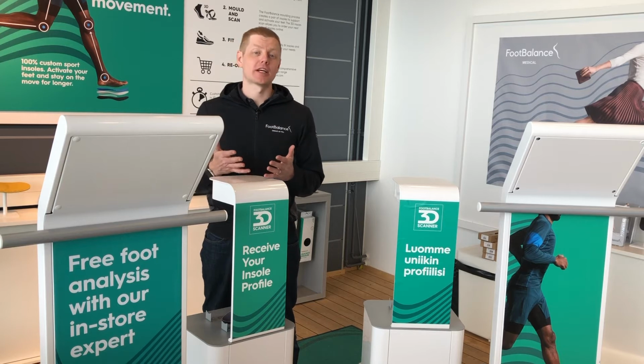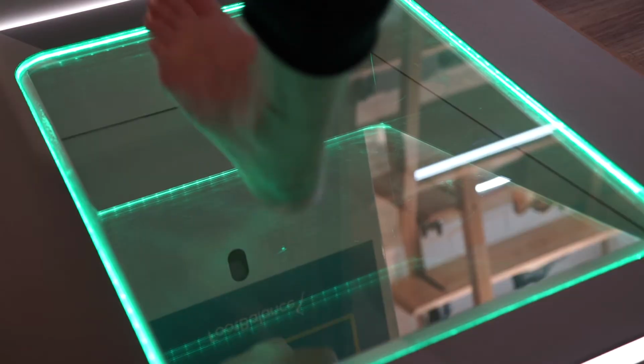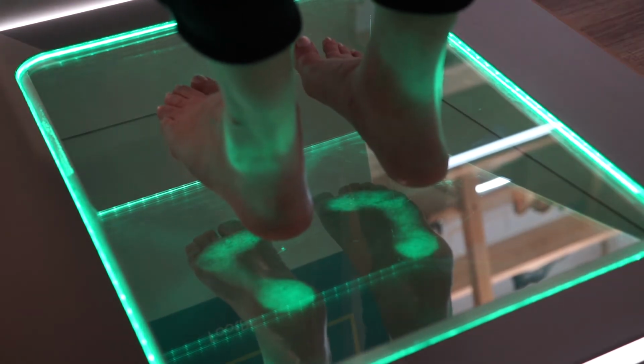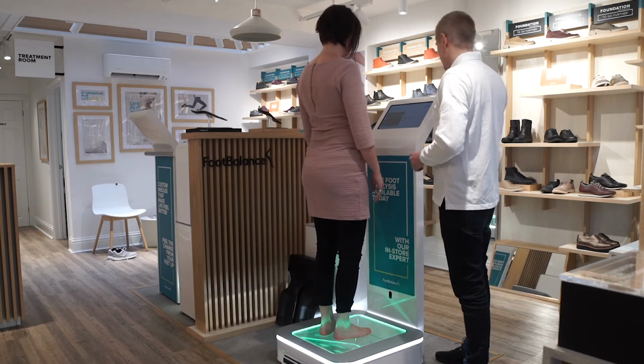In the beginning of the analysis, we asked the customer to step into the podoscope without shoes and socks and roll up their pants so that we can see their feet and ankles. We then explained that we start the analysis by checking their arch type.